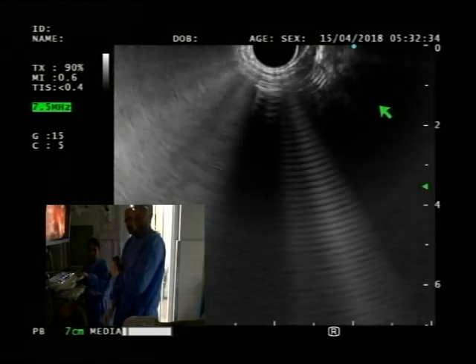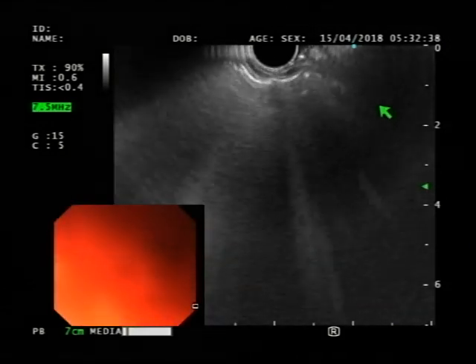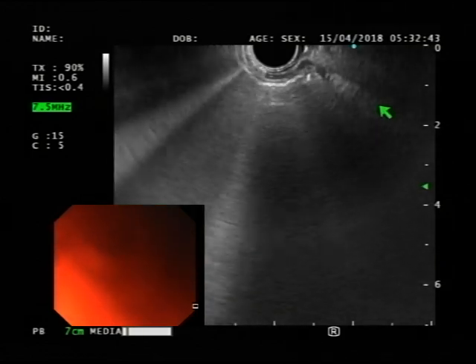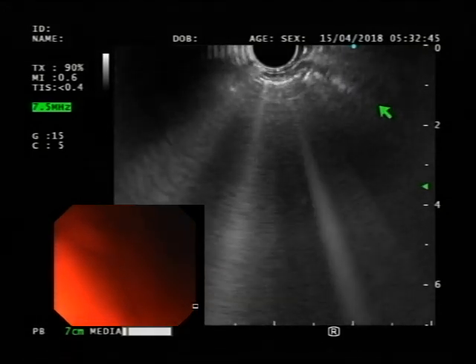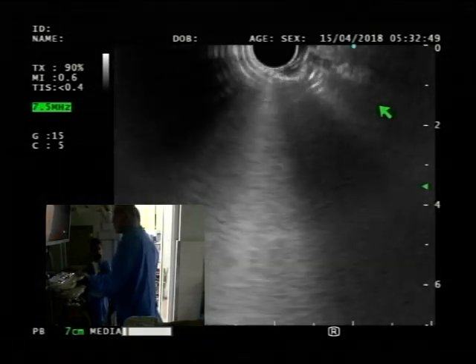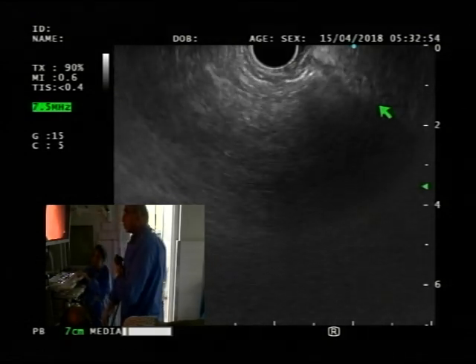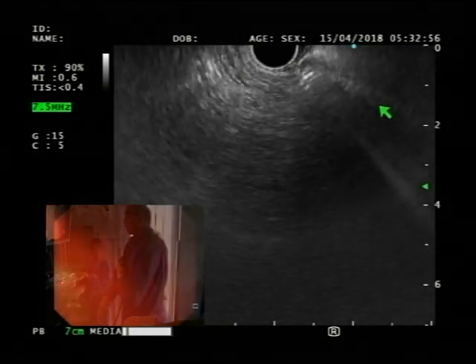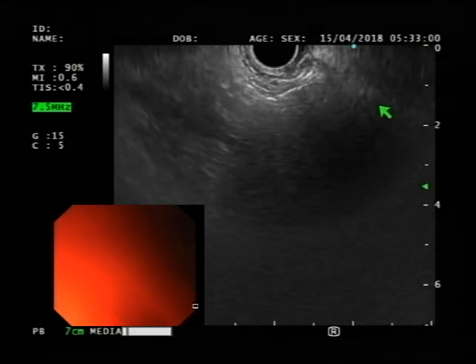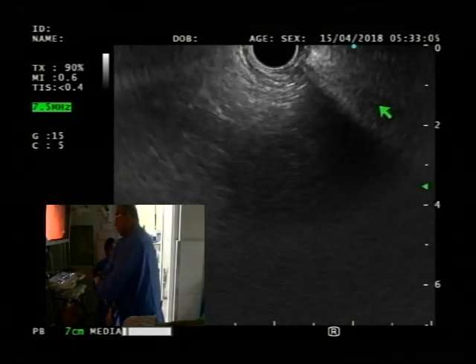There's your stent. And then hold it from here. Yeah, just relax yourself. There you go. And now go counter. Other way. Try the other way. If you don't see it, then go clockwise again. Withdraw your scope about a centimeter and do the same thing again. And go counter again.